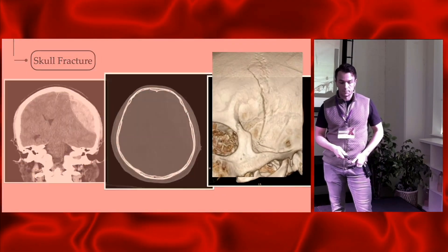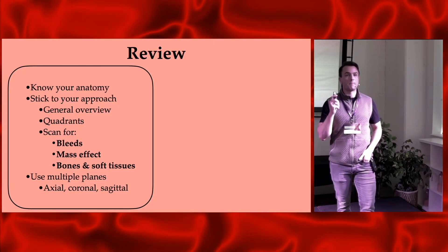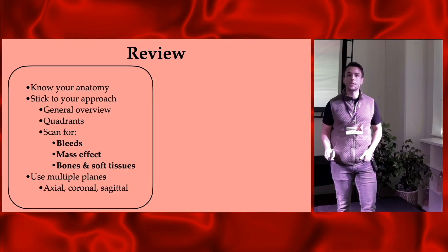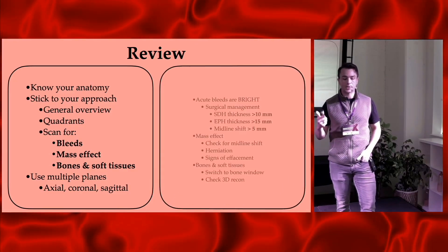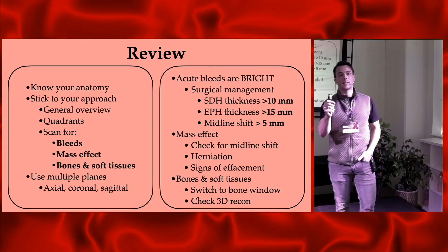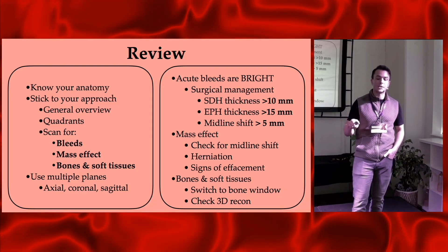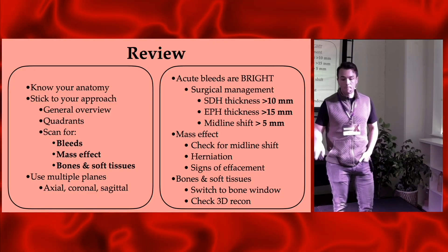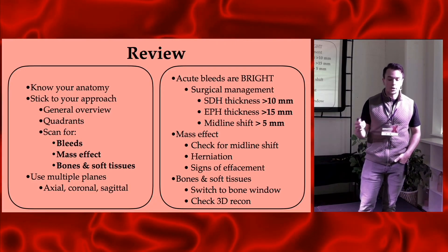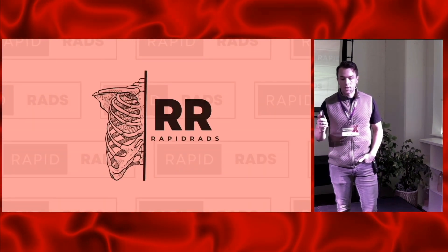In review: know your anatomy, stick to a systematic approach every single time. Scan your quadrants, compare both sides, looking for bleeds, mass effect, bones, and soft tissues in multiple planes — axial, coronal, sagittal. Acute bleeds are bright; the hematoma is bright but the active bleed within it is dark. Thresholds for neurosurgical intervention: subdural hematoma greater than 10 mm, epidural greater than 15 mm, midline shift greater than 5 mm. For mass effect: check midline shift, herniation, and signs of effacement. For bones: switch to bone window and check 3D reconstruction.